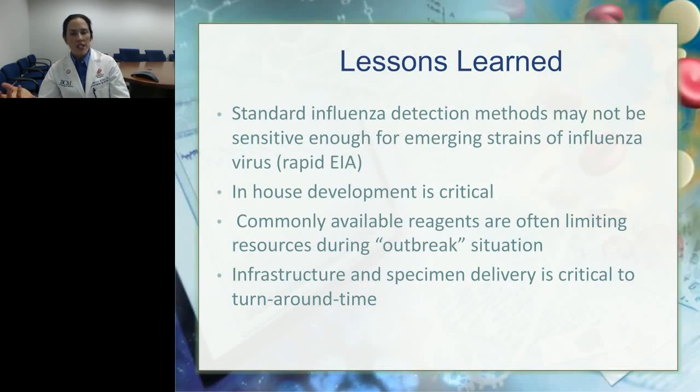So we learned that our standard methods weren't going to work, and we really needed the in-house development. We also learned, importantly, and these are two very important points here, that in situations where you have a massive outbreak, where you have this big surge in infection, common reagents that everybody else is using can become the limiting factor.